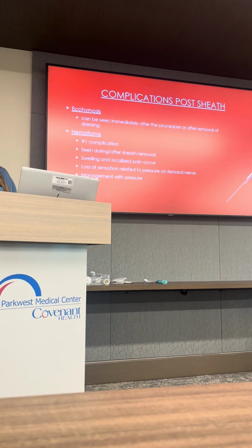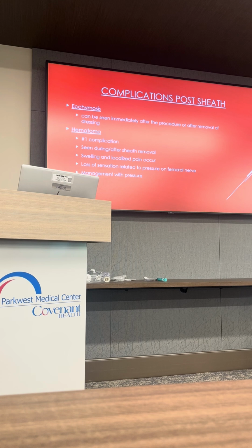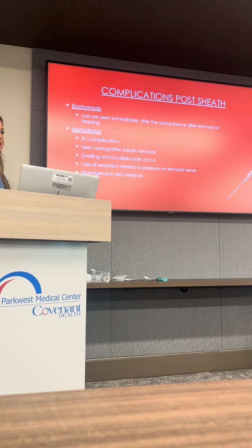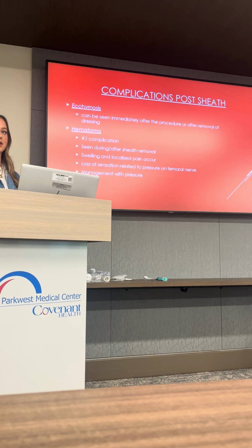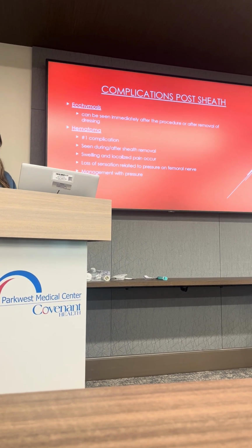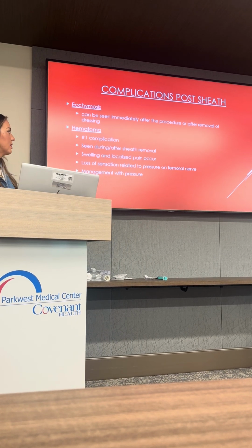Further complications post sheath removal. Oftentimes you'll see these patients have some pretty gnarly bruising. It's completely normal. It's not really anything that can be avoided. These patients are going to have some bruising because of the pressure that we hold. It's just part of it, but communicating that on the front end is always good, because some of these patients will the next day be like, gosh, what did you do to me? So it's nice to already let them know ahead of time that that's something they should expect.